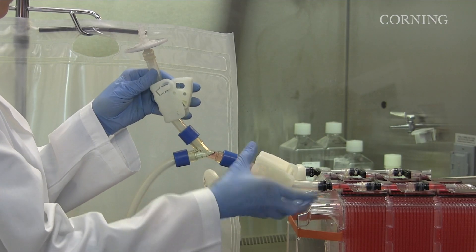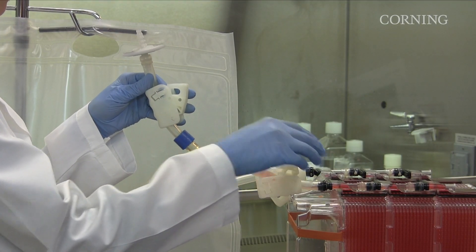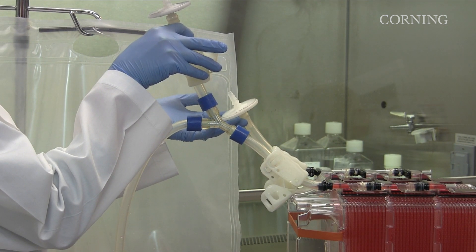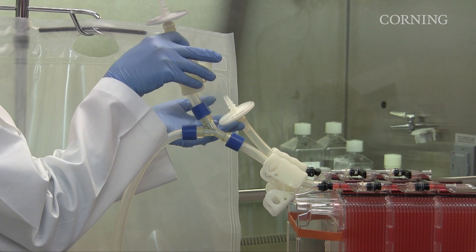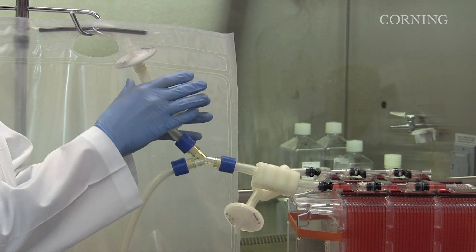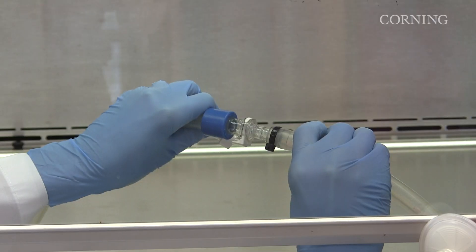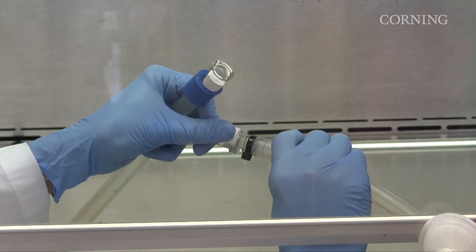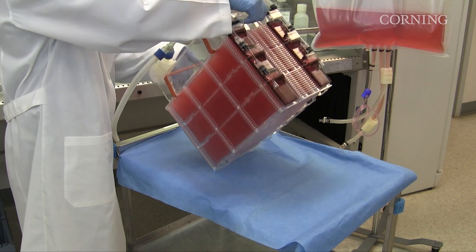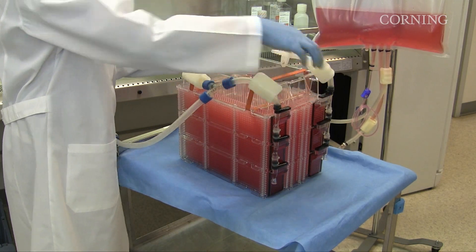Keeping the chase tube filter in an upright position, open the liquid handling tubing clamp. Liquid and air will equilibrate across all modules and manifolds. Close all three clamps. The source container can either be disconnected in the hood or left attached to the Hyperstack vessel during incubation. Turn the vessel back to the incubation position.